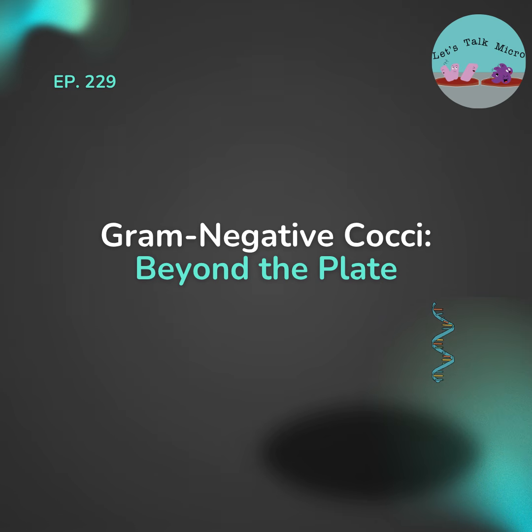And in this panel, one of the targets is Neisseria meningitidis. So if it's present, you can get that ID. So before, in the case of blood, in the lab, you plate it, you do a culture, but before you do this and recover the organism, you can have that ID and give it to the physician so they can start treatment. And there are other systems that do this as well.